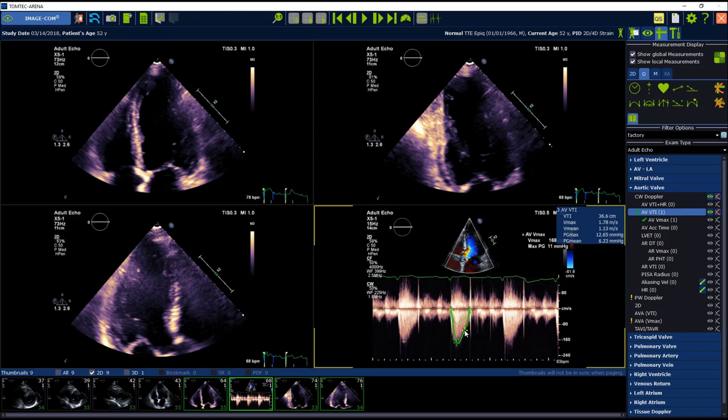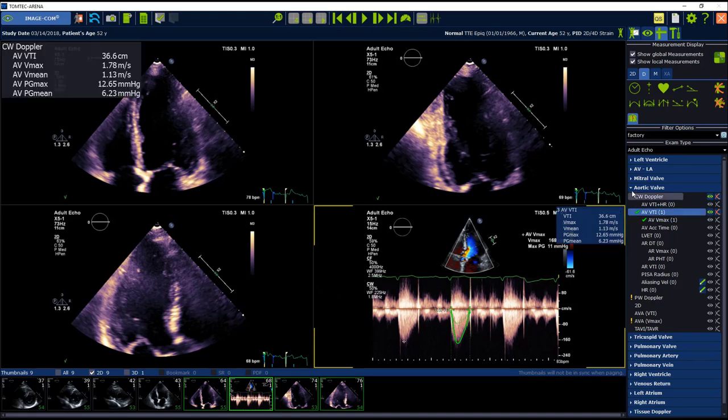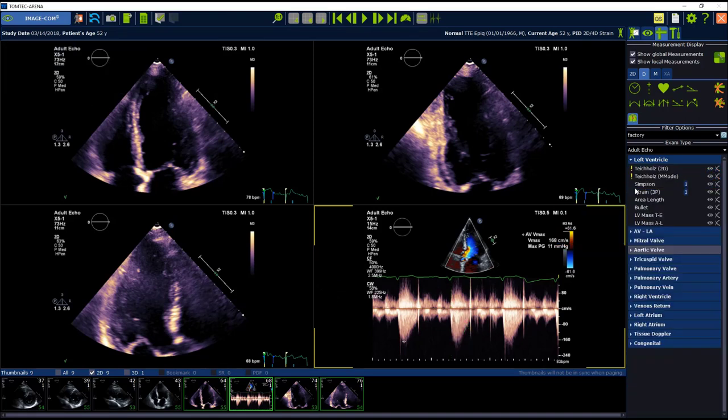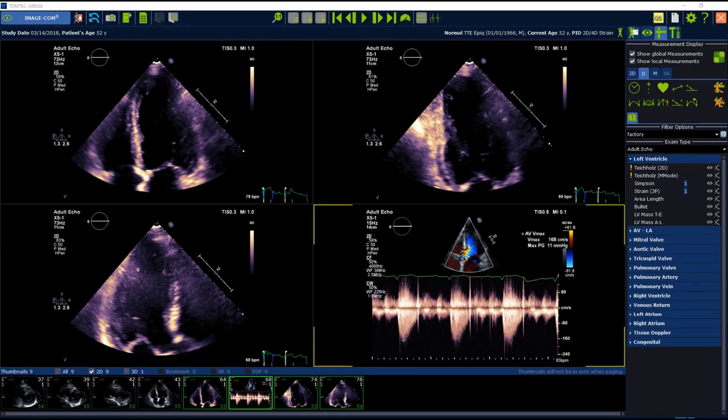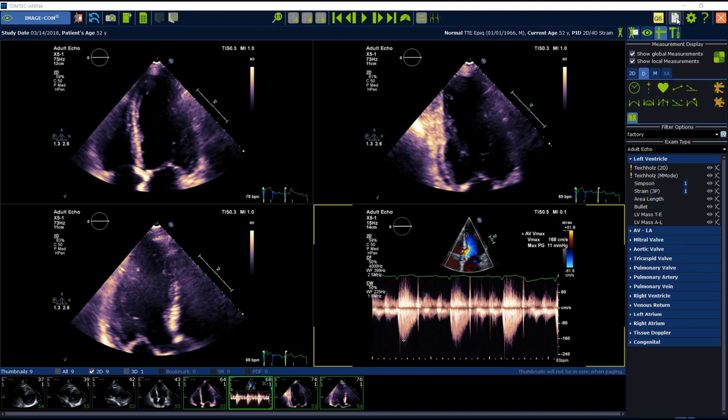After doing my measurements, I can change the study status to analyzed. I can do this here in image com on the top, as well as in the study list. After performing the measurements, please go on the reporting module. If you do not have a dual monitoring, you can find the icon for the report on the right upper hand corner.